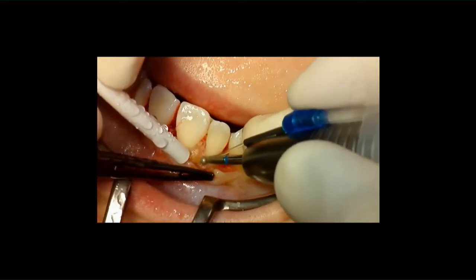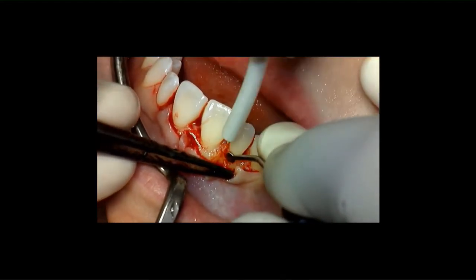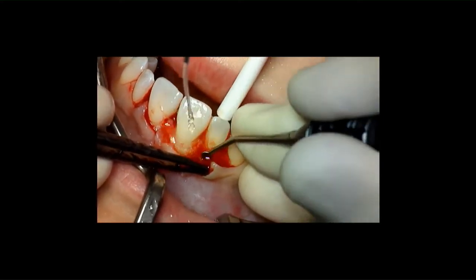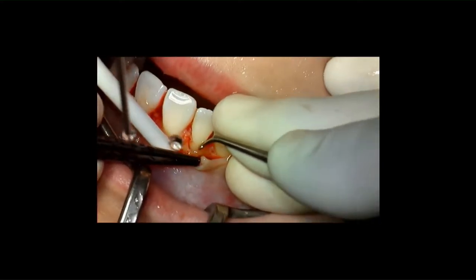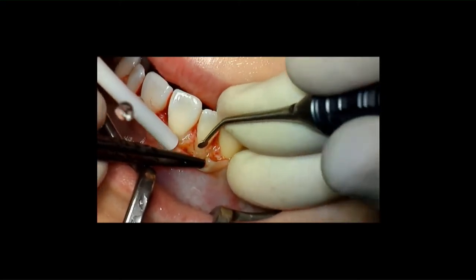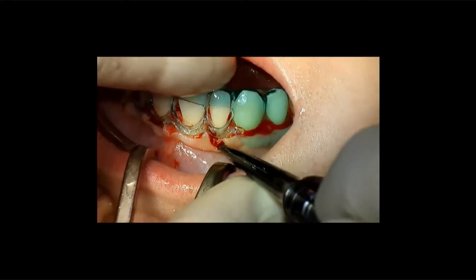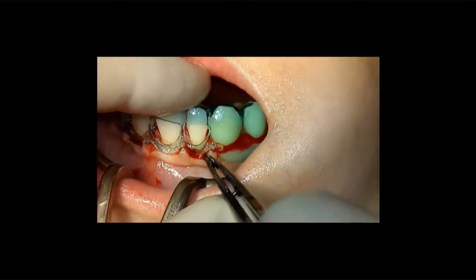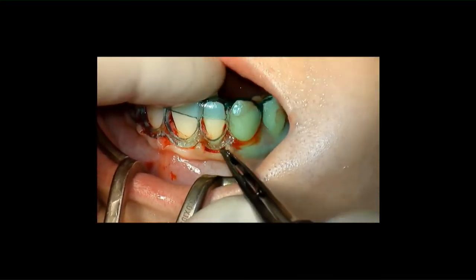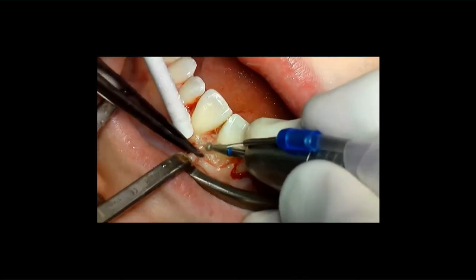Okay, here we have just the straight handpiece, diamond burs, and I reduce the bone thickness. I do not remove all the bone to the root surface. I reduce the thickness, and then I apply a pressure and remove the final bit of bone in order not to destroy the root surface.